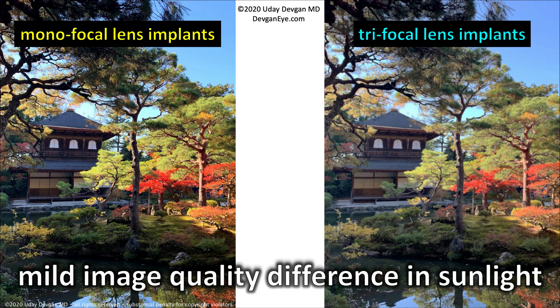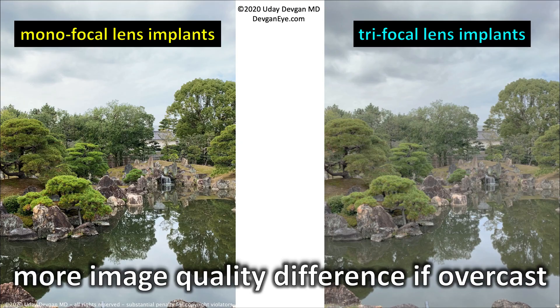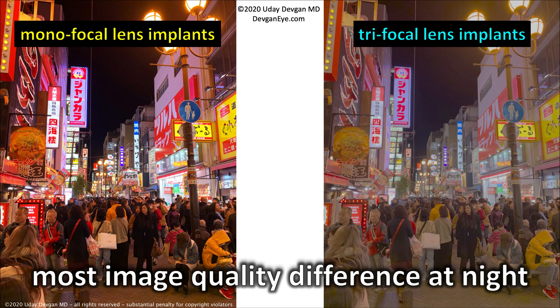Comparing the monofocal on the left to the trifocal on the right: in bright sunlight the image quality for both is pretty good, though the monofocal is a little more vibrant and sharper. In the shade there's a little more image quality difference — the trifocal image is just a little less contrast, not quite as vivid. There's more difference when it's overcast outside. And it's most pronounced at night, where the monofocal gives a bright, clear image, while the trifocal is technically sharp but contrast and clarity aren't quite the same.